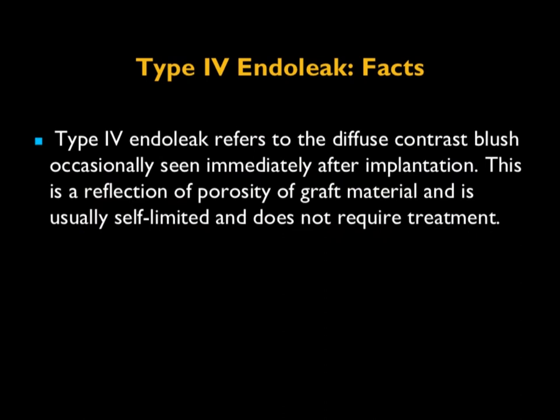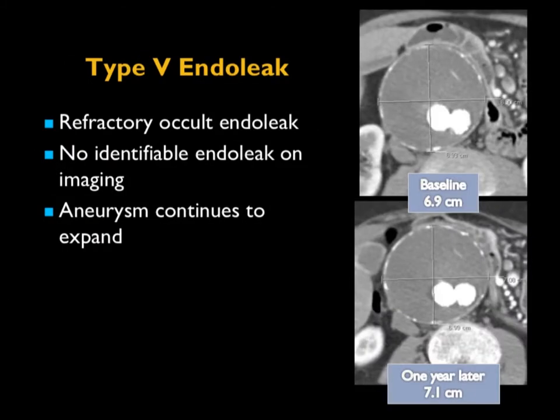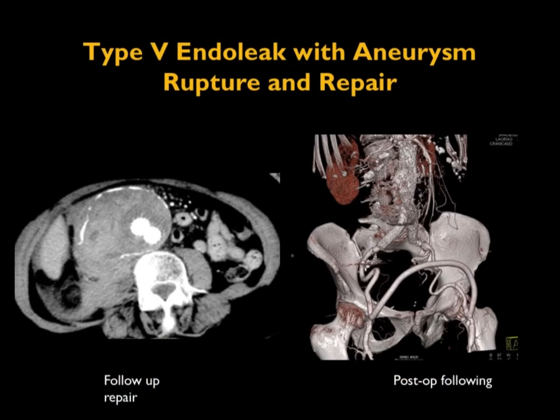Type four refers to diffuse contrast seen immediately after implantation — a reflection of graft material porosity, usually self-limited and not requiring treatment. Type five is a refractory occult endoleak, meaning you cannot see the reason why the aneurysm is increasing in size post repair, but it is enlarging. You can see the aneurysm here enlarging from 6.9 to 7.1 with no obvious endoleak. One year post embolization it was seven centimeters, two years later 7.6 centimeters, and eventually the aneurysm enlarged and ruptured with a retroperitoneal bleed. The patient subsequently had a fem-fem graft.